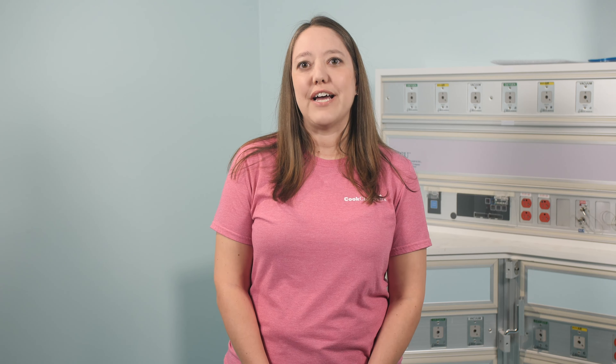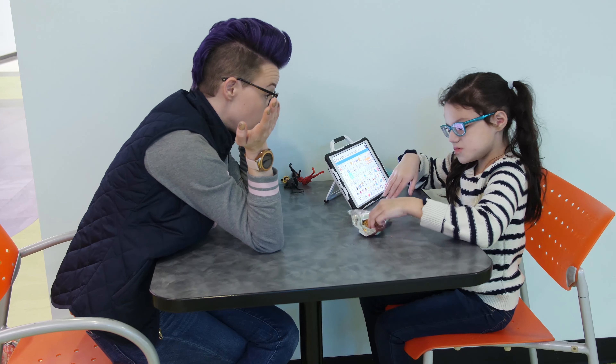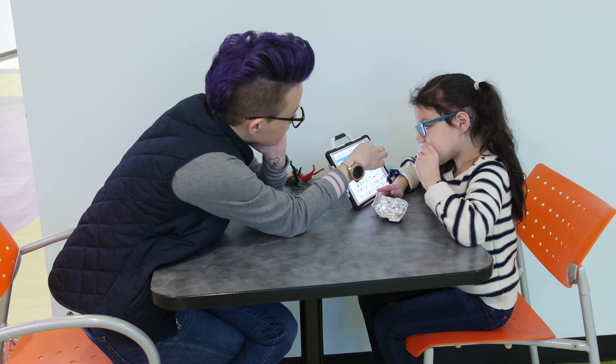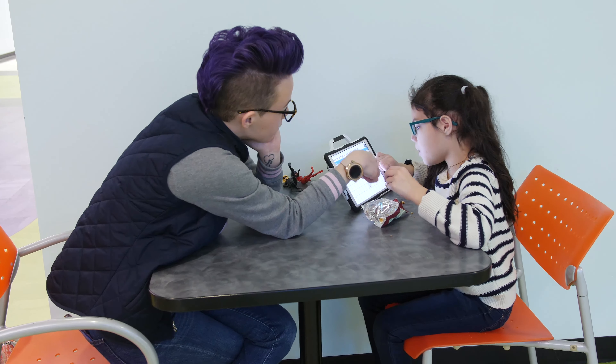You can use a single word or even a phrase or sentence. Learning how to use the device is all about learning language. Let's look at another video of how your child can use the device. It's a cookie. Is it good? Good.